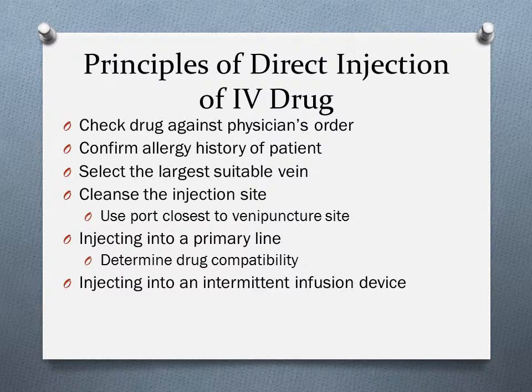Make sure that you allow that antiseptic agent to dry naturally, and if you inject into a Y injection port of an IV administration set, always use the port that is closest to the patient, in other words, the one closest to the venipuncture site.